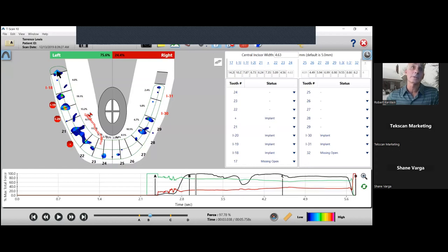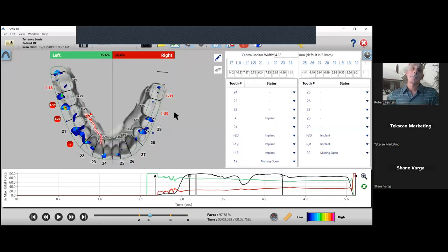And so I know this is the distal aspect of 18, and this is the distal buccal cusp of 19, mesial buccal cusp of 19, distal aspect of 20. And if I put the digital arch on, I see the exact proper marginal ridge alignment. So that's a unique situation. That's when you have to add a tooth, but the principles are the same. If I didn't have to add a tooth, I'd still have to line the marginal ridges up correctly.